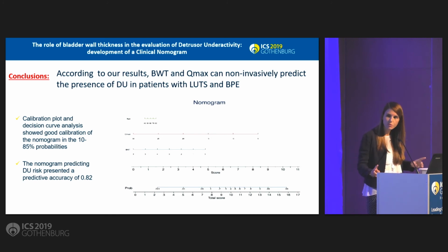We only have two centers that joined the data, so that should reduce the number of investigators. We selected one investigator for each center, so those two men did the ultrasound, and they checked with the same probe. So we tried to limit the difficulty of that. But yes, it's not easy, especially with the probe. We suggest using the linear probe, but it's not always available all around the world.